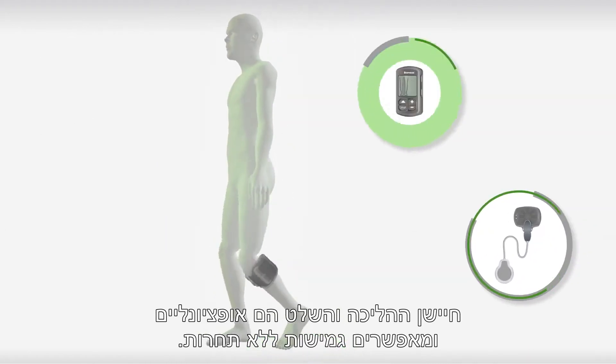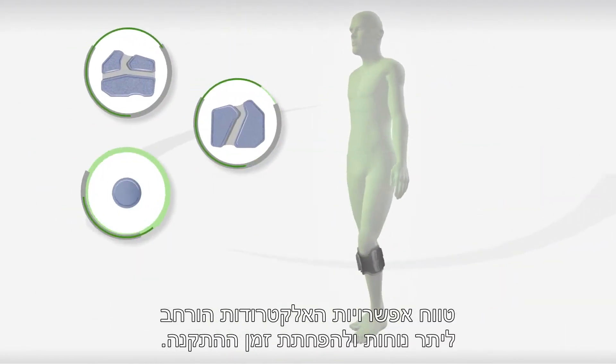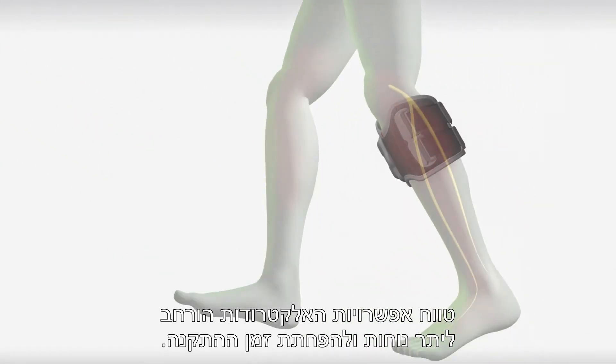The gait sensor and control unit are optional, allowing unrivaled flexibility. Electrode options have been expanded to enhance comfort and reduce setup time.